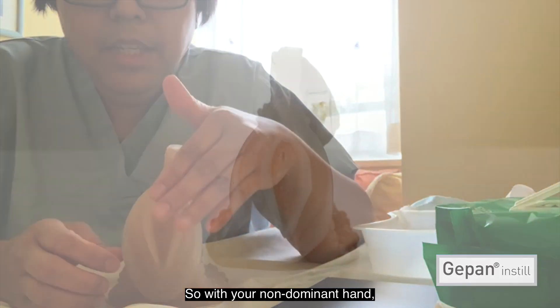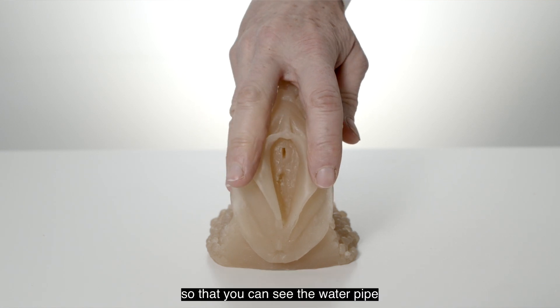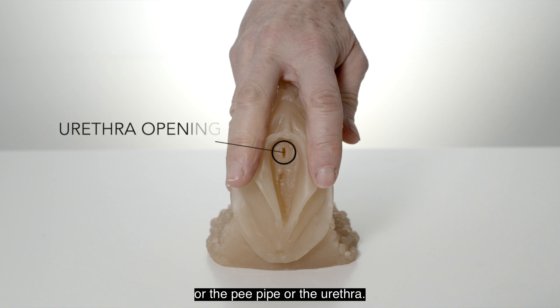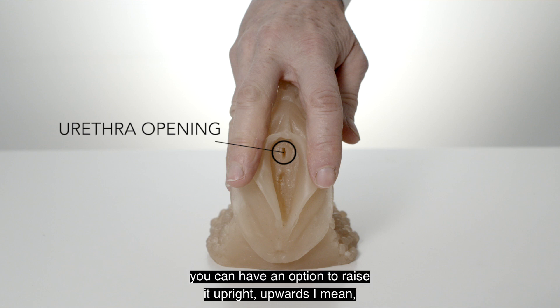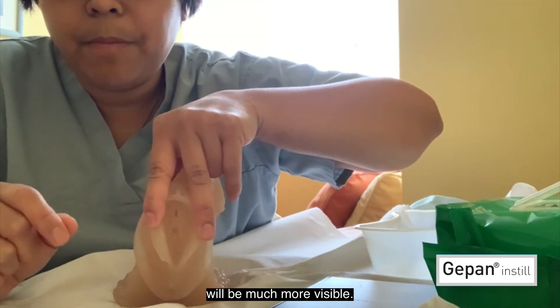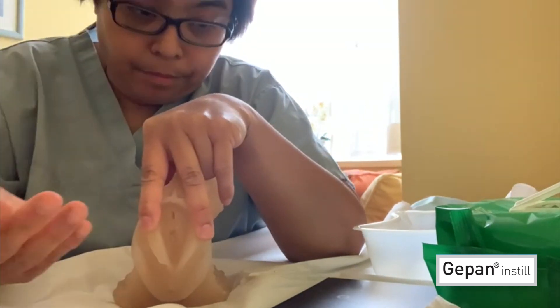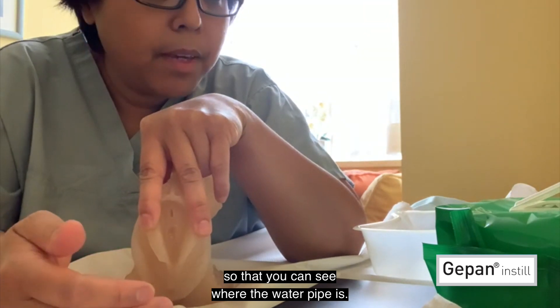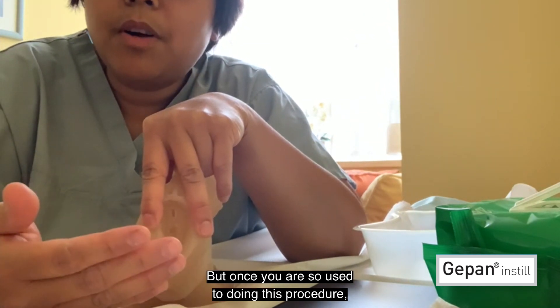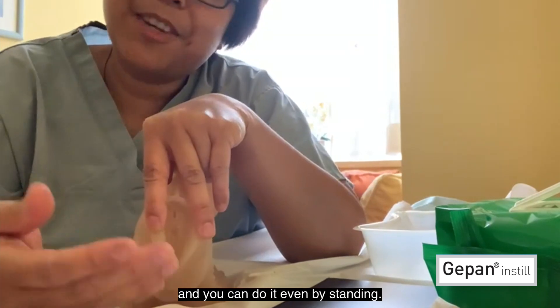With your non-dominant hand, separate your labia using your fingers like this so that you can see the urethra. If you find it a little bit difficult, you have the option to raise it upwards so that you can see it clearly — sometimes the urethral opening will be much more visible. You have a mirror in front of you so that you can see where the urethra is, but once you are used to doing this procedure it will be a lot easier, and you won't need the mirror and can do it even standing.